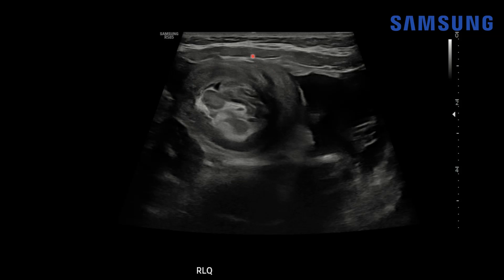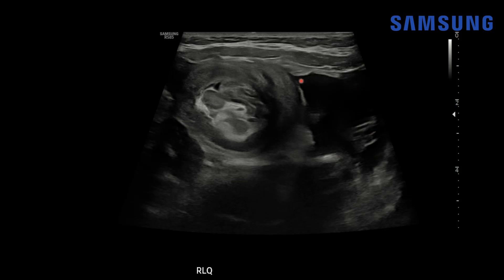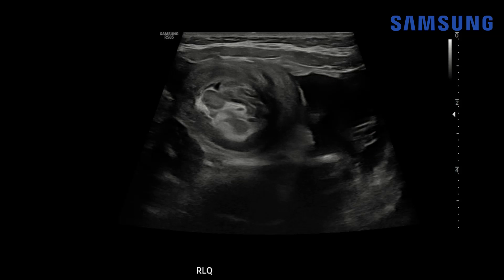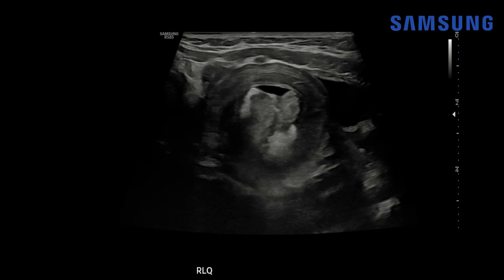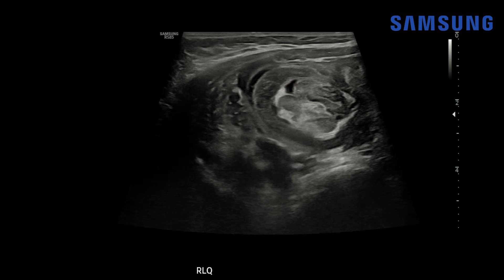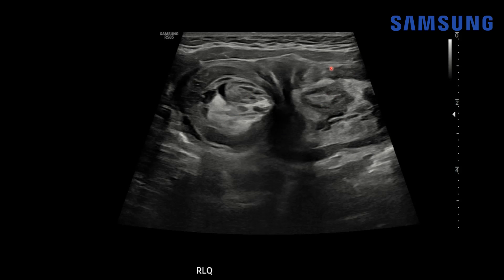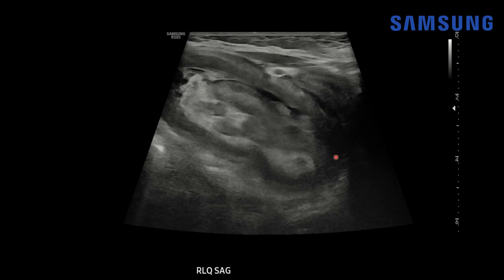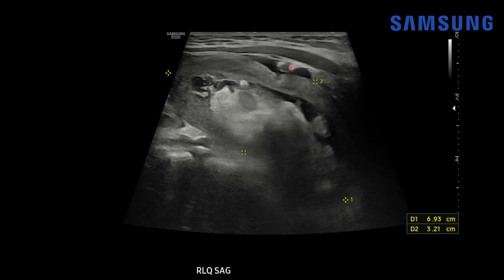Let's finish with a complicated case. This was a six-month-old female with a one-day history of non-bilious projectile vomiting and a concerning history of bloody diarrhea. In the right lower quadrant we see a target appearance containing mesenteric fat and lymph nodes, typical for an ileocolic intussusception. We also see some anechoic simple free fluid, which by itself is not typically concerning and can be seen in about 50% of intussusception cases. However, there's also fluid within the intussuscipiens — that's a more concerning finding. The bowel wall is heterogeneous and hypoechoic with a tethered appearance, and on long axis it measures nearly seven centimeters — much larger than three centimeters. We again see fluid within the intussuscipiens and surrounding the intussusception.